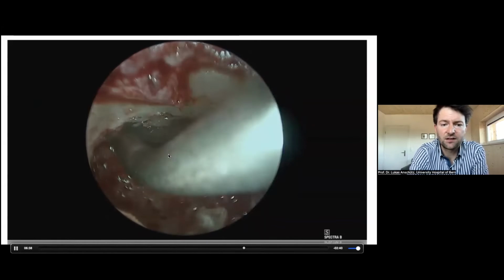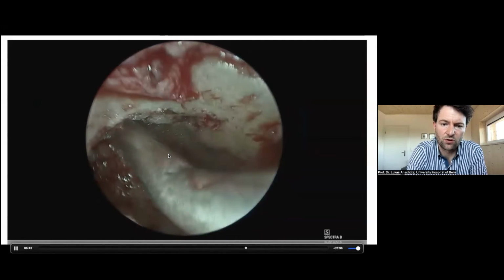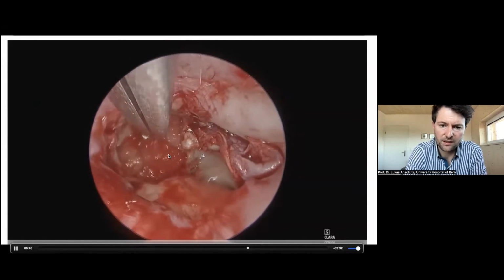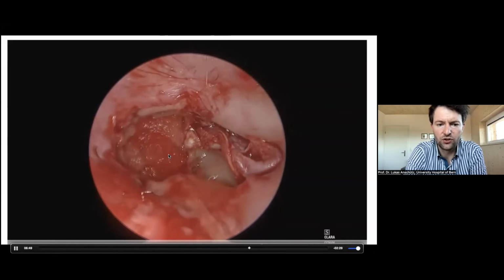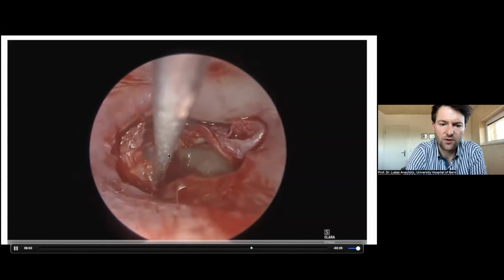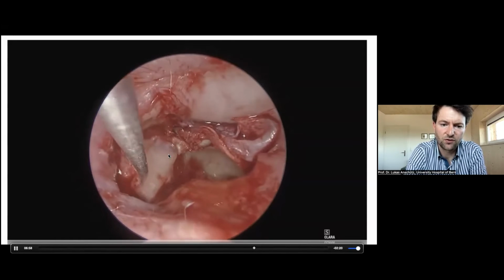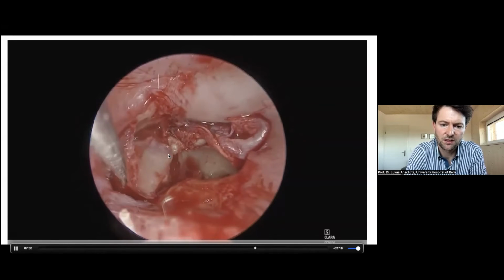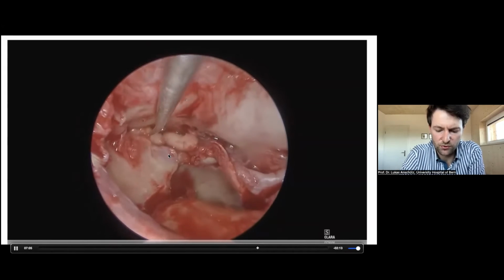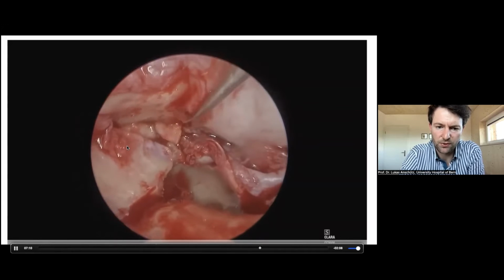But like here, you can be quite confident that the cholesteatoma is all gone, and that you can safely reconstruct your site. And so it's the same technique as you saw before, some gel foam and a piece of cartilage into the antrum in a composite graft technique. And you can see here, it was a bit too small, so I put another piece of cartilage here to completely close up the defect.